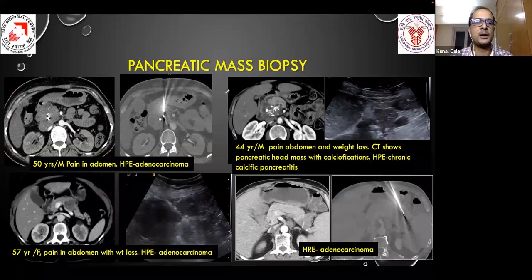So coming on to the pancreatic biopsy, it can be performed with the help of either ultrasound or CT scan guidance. And what we can do, we can compress the stomach. A patient needs to be nil by mouth for at least 4 to 6 hours, since the stomach needs to be empty, and the patient needs to be counseled regarding the post biopsy. The patient needs to be NBM for at least 4 to 6 hours if one has transgressed the stomach, and can do a biopsy.